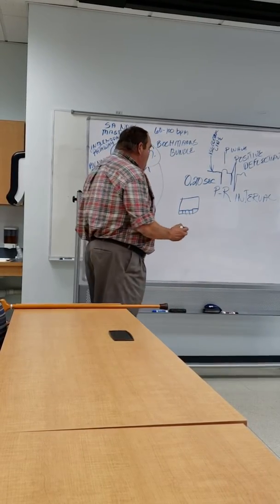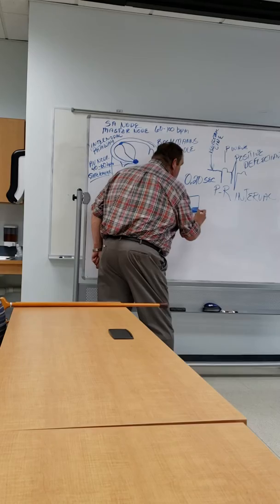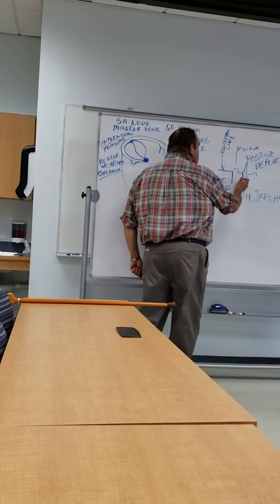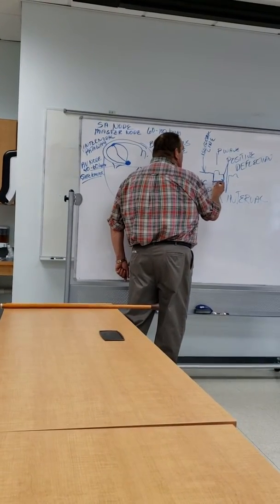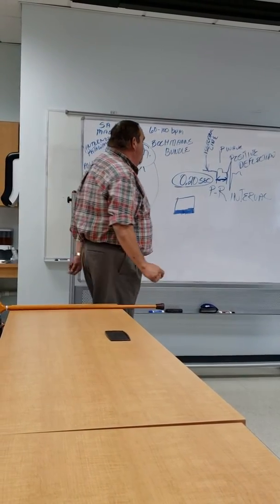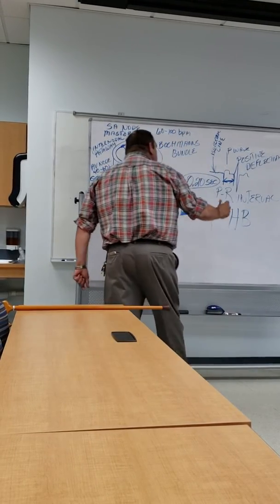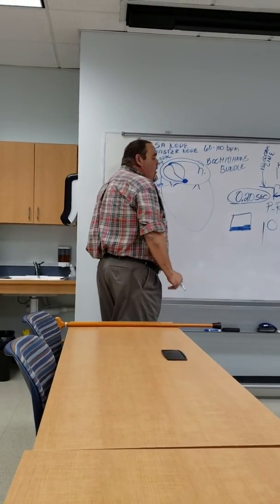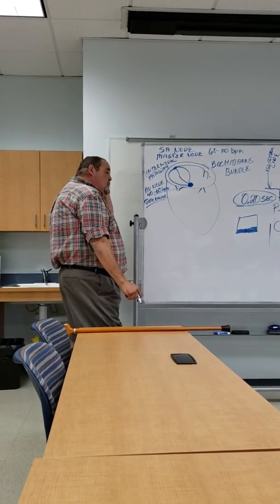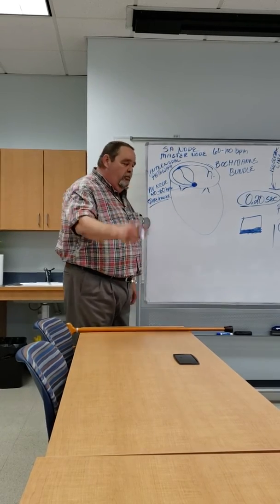Now do you understand why you need to know about this time? Because you're using it to see if this is in the parameters it's supposed to be. If this distance right here between the P wave and the beginning of QRS is greater than this, longer than one big block, it's a first degree heart block, which just means this AV node right here is holding the impulse too long. In EMS, there's nothing you can do for a first degree AV block but look and watch for other blocks to follow.